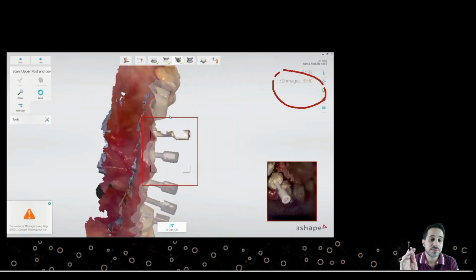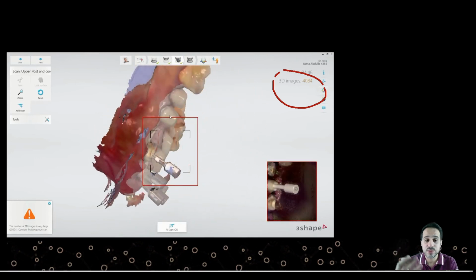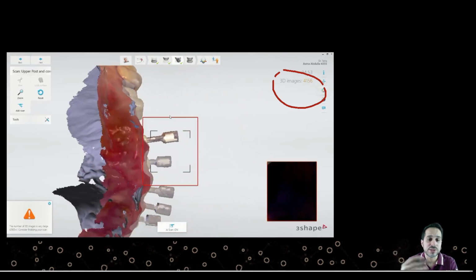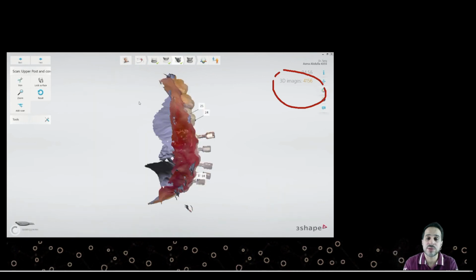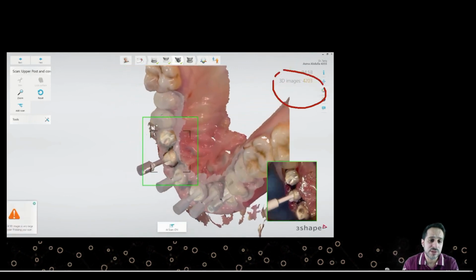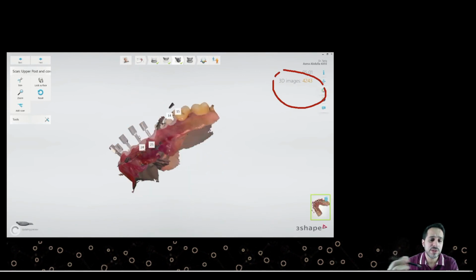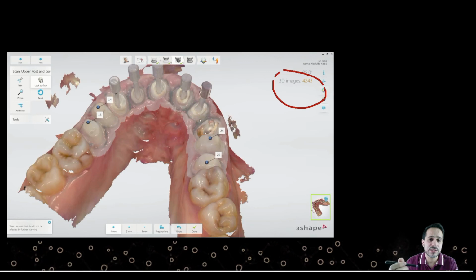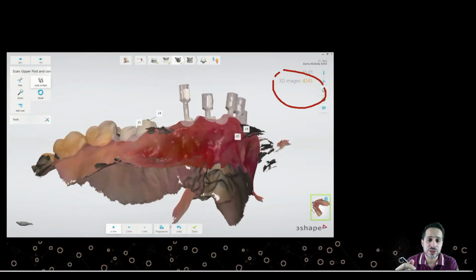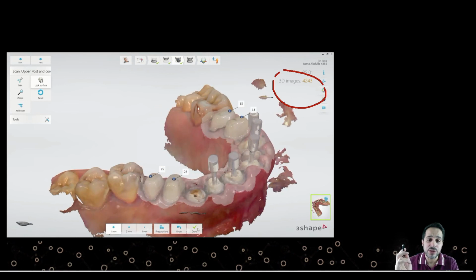So in the traditional way, you need to do a fiber post, composite buildup, take an impression, send it to your lab, check the fitting, and send it to your lab again. Or you can try a custom-made Richmond post. It's an old technique where you drop wax inside the canals and try to take an impression of the canals. But here we already get the final scan and the post scan.